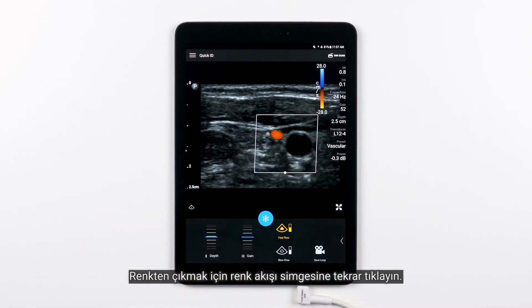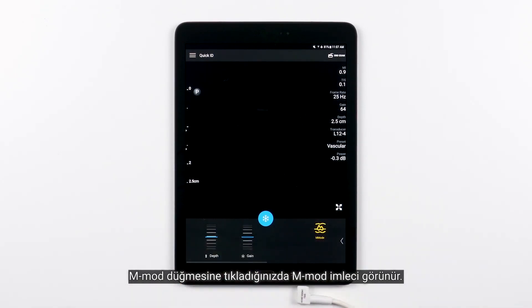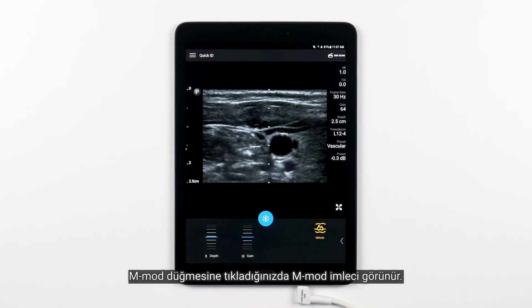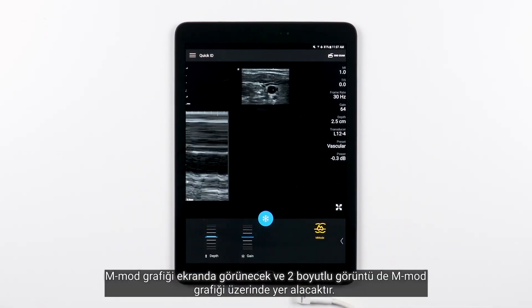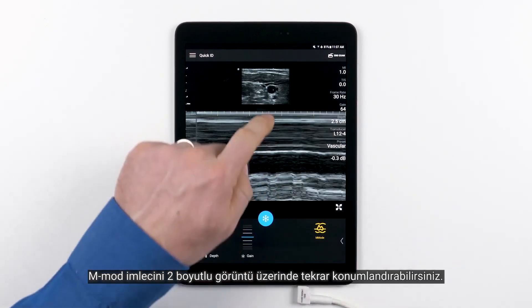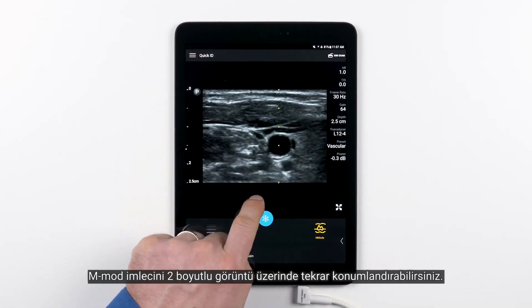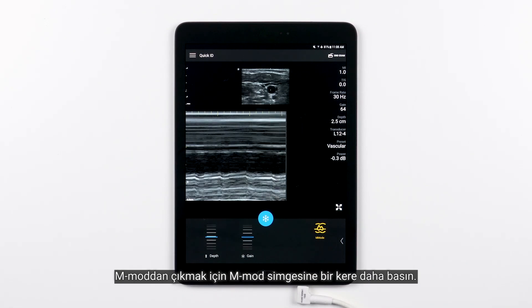To get out of color, simply tap the Color Flow icon again. Now let's review the M-Mode feature. When you touch M-Mode, the M-Mode cursor will appear. Move the cursor to the desired location. The M-Mode trace will appear and the 2D display will be above the M-Mode trace. You can reposition the M-Mode cursor on the 2D image. To get out of M-Mode, simply press the M-Mode icon once more.